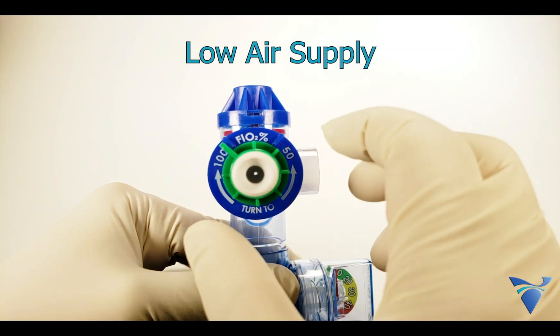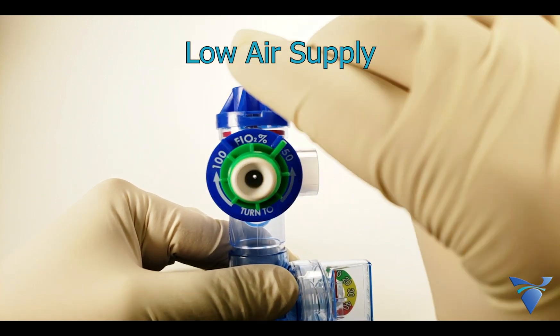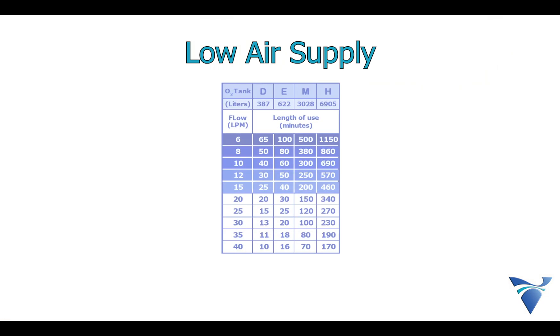In the field or during transport, consider taking advantage of the GoToVent's 50% FiO2 entrainment feature to conserve air. Consult the instructions for use for approximate operating times on various cylinder sizes to ensure you have a sufficient amount of air available.